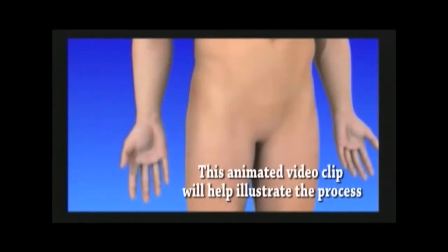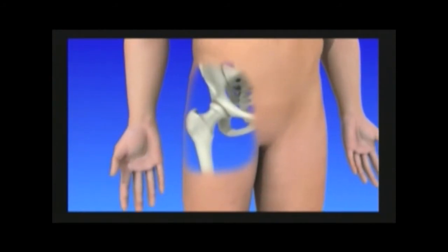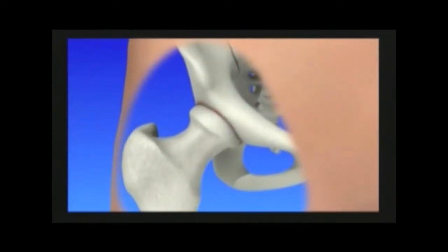So a hip arthroplasty involves removing the ball of the hip. We do an incision that's usually about this big. To begin, the surgeon will make an incision to access the joint. The hip joint is then opened to allow the surgeon to remove the damaged bone and cartilage. The head of the thigh bone is removed, which allows the surgeon to see the hip socket.